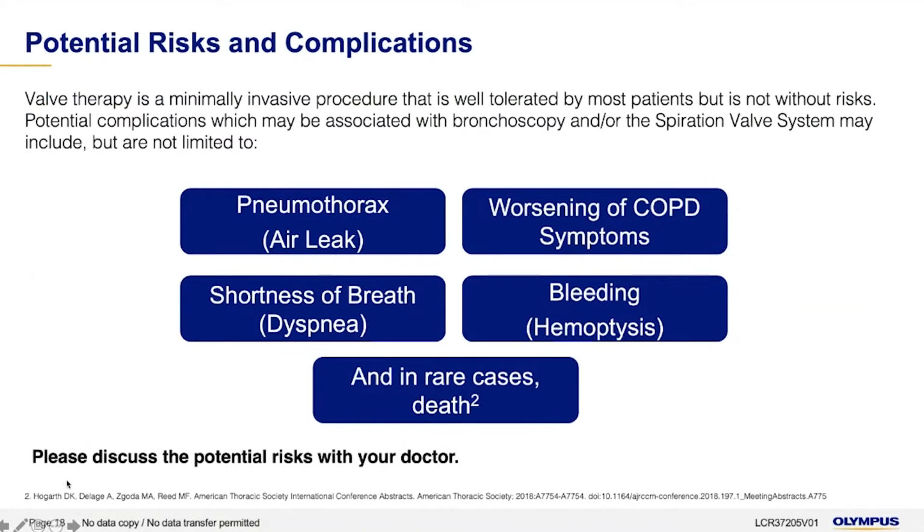One patient in the studies died. I will say specifically they did not die directly from the valves because here's what happened. Their lung did collapse. They had the pop. The local emergency room, when they put the tube in, which is a standard procedure and there's a specific way to do it, and whatever way this emergency room did it was not remotely the correct way, and they pushed the thing all the way into the patient's artery, and the patient essentially bled to death instantly.